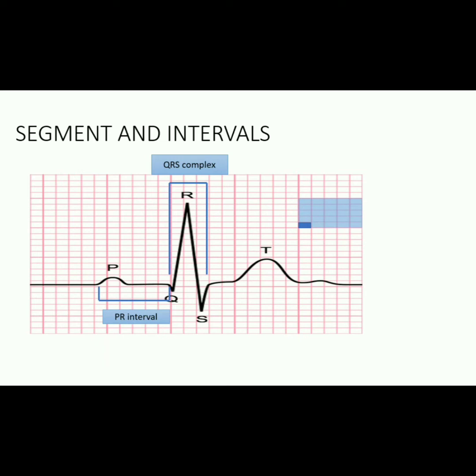To interpret a basic ECG, you just need to know about PR intervals and the QRS complex. So just make a note of it. We will find an ECG strip, a normal ECG strip like this, a plain ECG strip, and you will find small boxes in it. So I have mapped it here. You can see a big column, and inside this column you will find small boxes. I'll show you more closely.